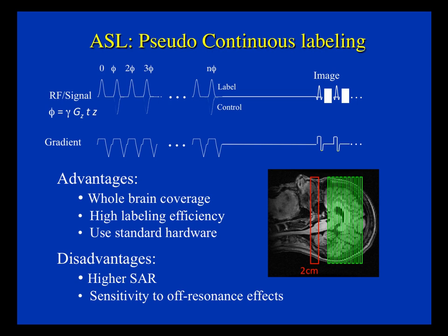As I said, continuous ASL works well, but it requires special hardware, so it's difficult to implement. In the last few years, we saw the development of a technique called pseudo-continuous ASL, which does not require special hardware.